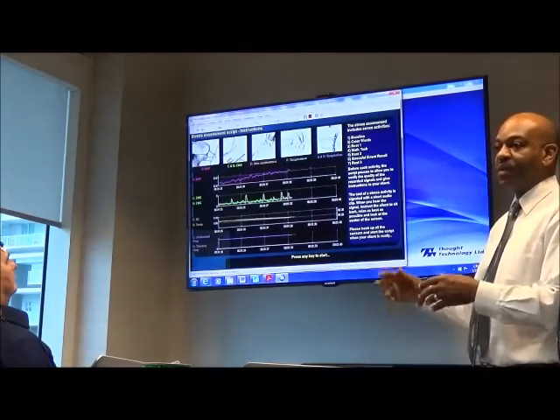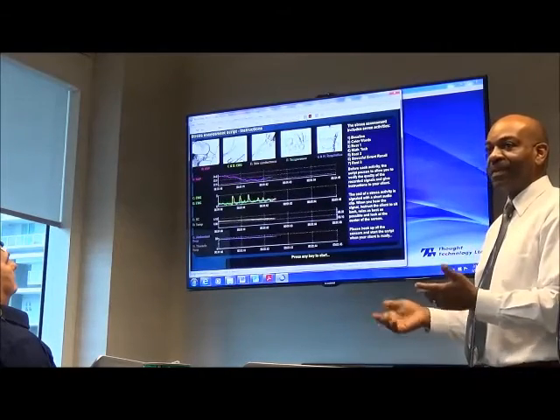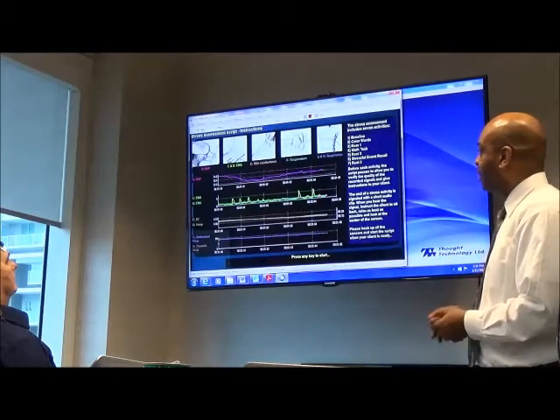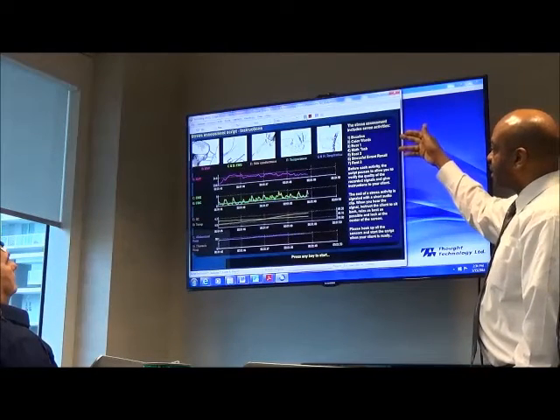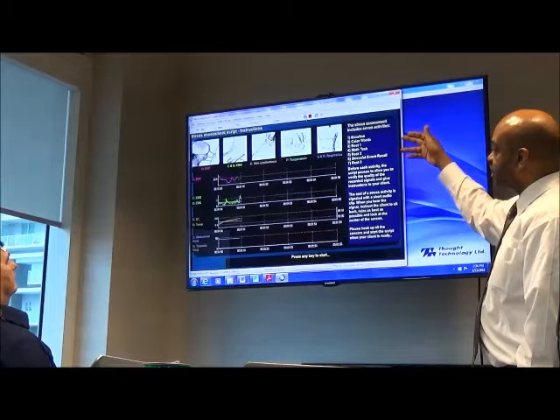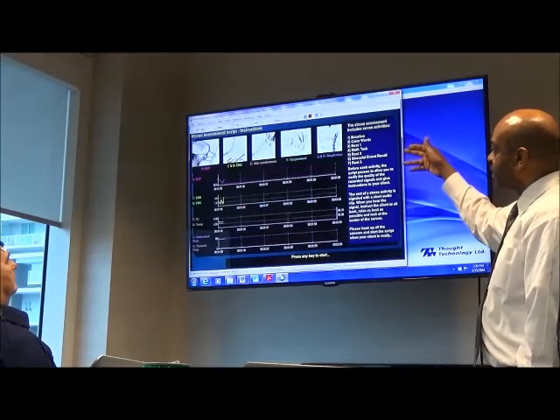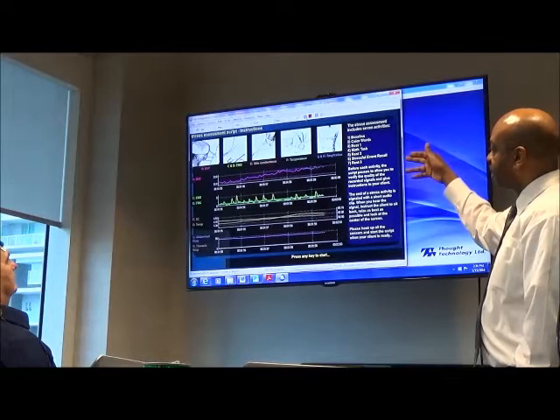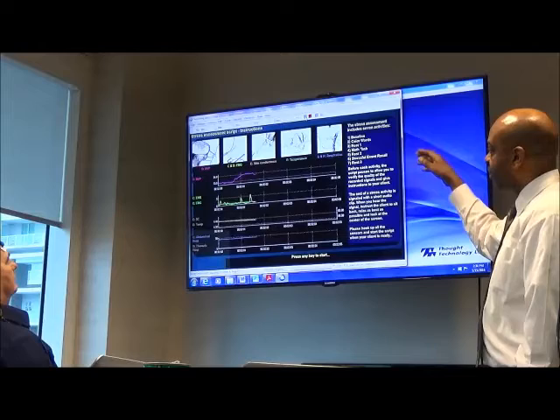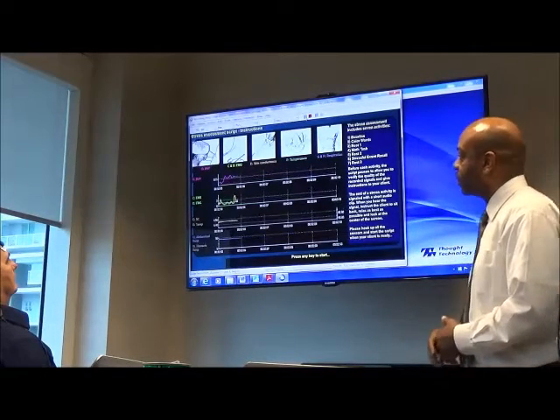Because many times if you don't explain to them, they're going to be talking to you during this and it messes up the results. So the first part is going to be baseline. Then you have the color words, which is a stressor, and then rest 1 is a recovery, then the math task. Rest 2 is another recovery, stressful event recall, and then rest 3 is the last recovery, and then I would save the data and go over it with them.